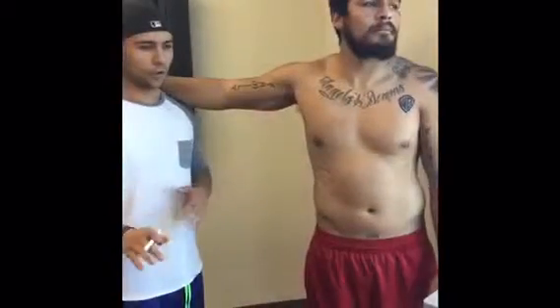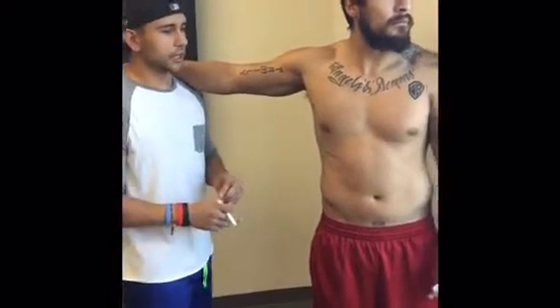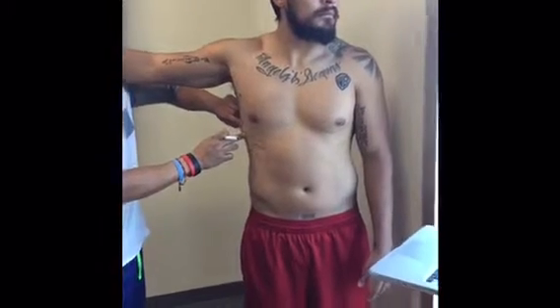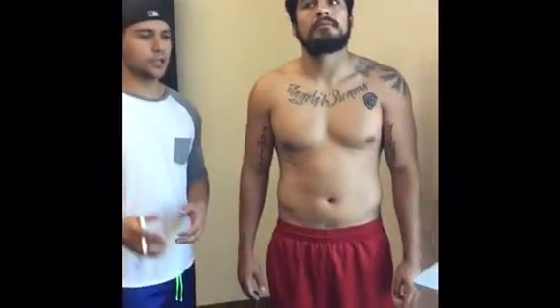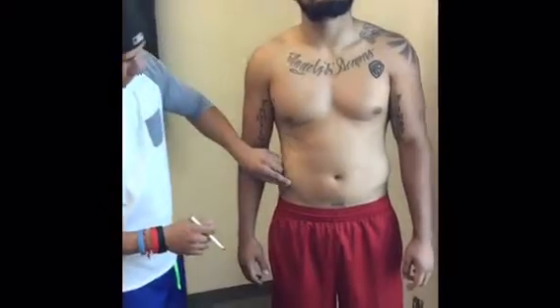Okay guys, so the fourth site that we're going to be taking is the mid-axillary point. The mid-axillary line is at the level of the xiphoid process, at the level of the sternum. So it's going to be a vertical fold right about here. Fifth site that we're going to be taking is the suprailiac. It's a diagonal fold. It's the mid-axillary line superior to the iliac crest.